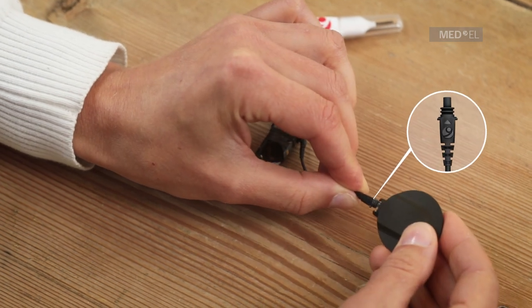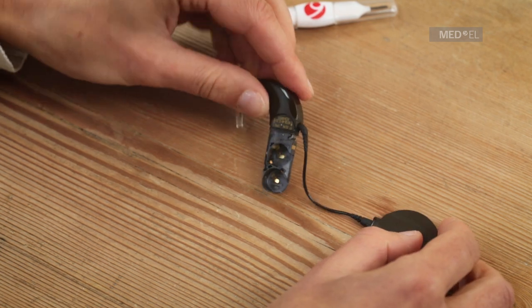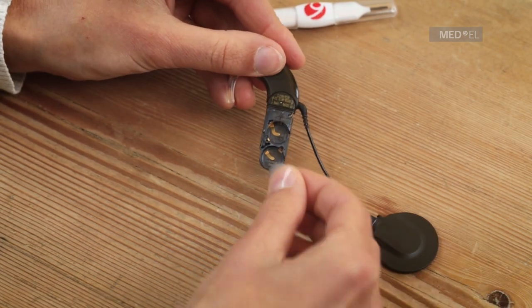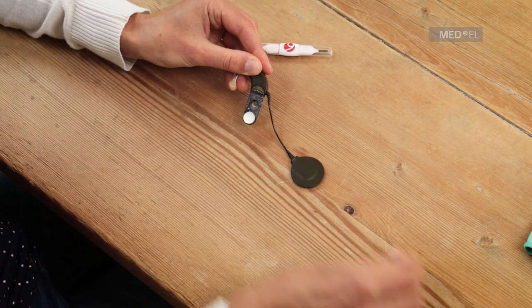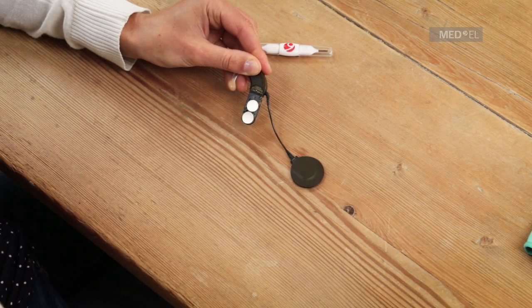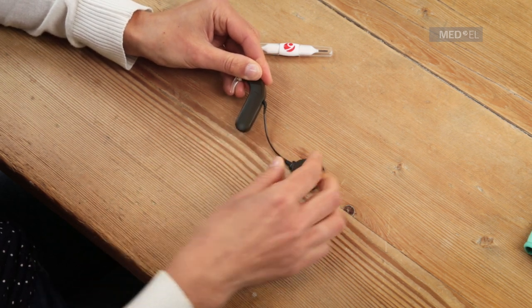Next, insert the batteries with positive plus poles facing out. Finally, slide the battery pack cover over the frame. If cleaning and drying your audio processor doesn't solve the problem, use the speech processor test device to troubleshoot your audio processor.